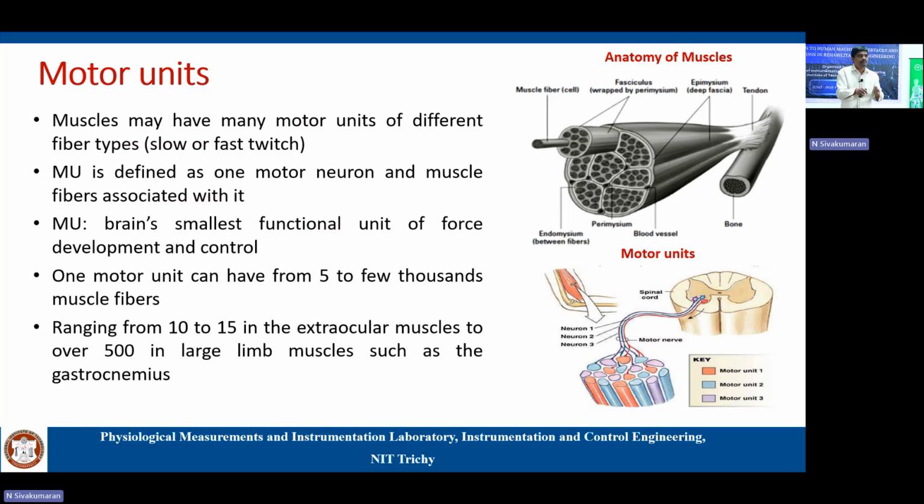And these few muscles that are recruited right now also sometimes change with time. For the same activity, you can see a difference in muscle activation, and this also affects the EMG. That is where the processing comes in. Yeah, we will see that.